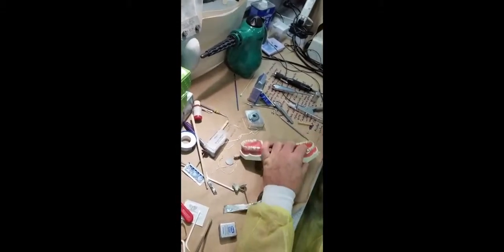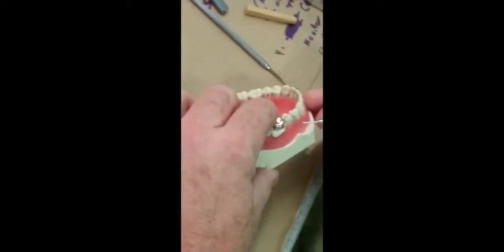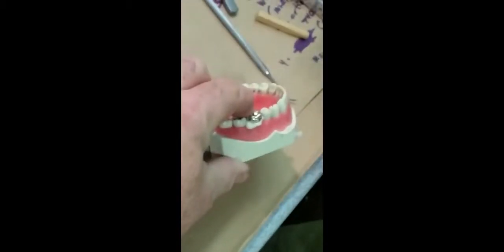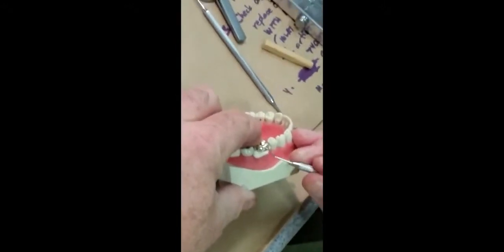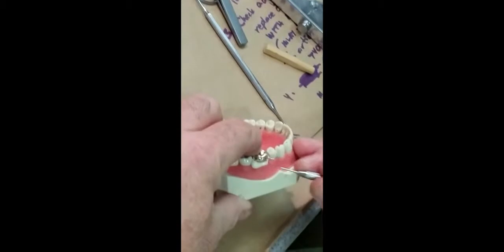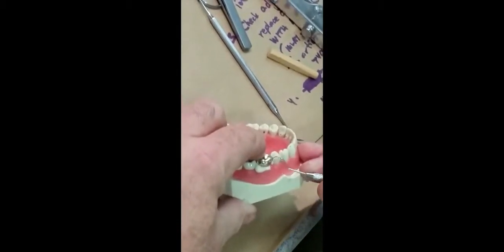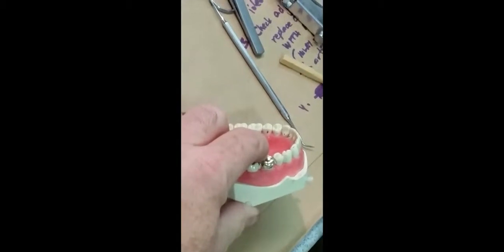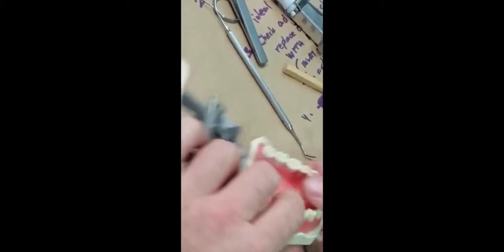At this point, you're following the set of the cement — and I wasn't doing that carefully. It's about where I want to clean up. It almost looks rubbery, or crumbly — it depends on the cement you're using. But you don't want to let it get hard; it will actually peel off. If you try to clean it off earlier, you smear it and get cement on everything — it sticks to the tissue, the teeth, the cheeks. Just leave it alone and feel it.